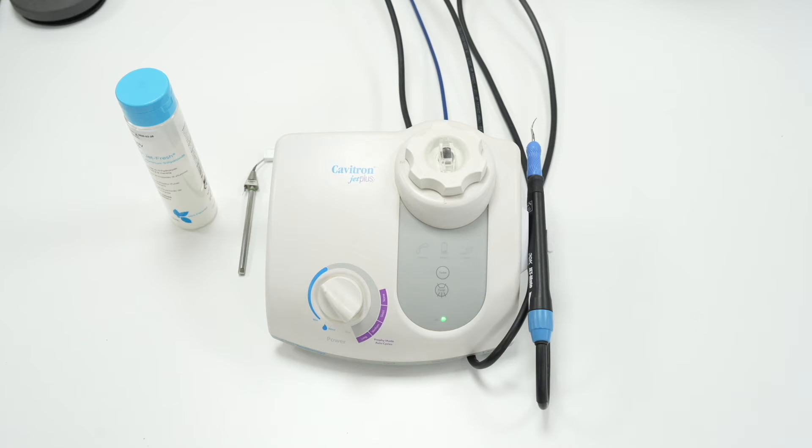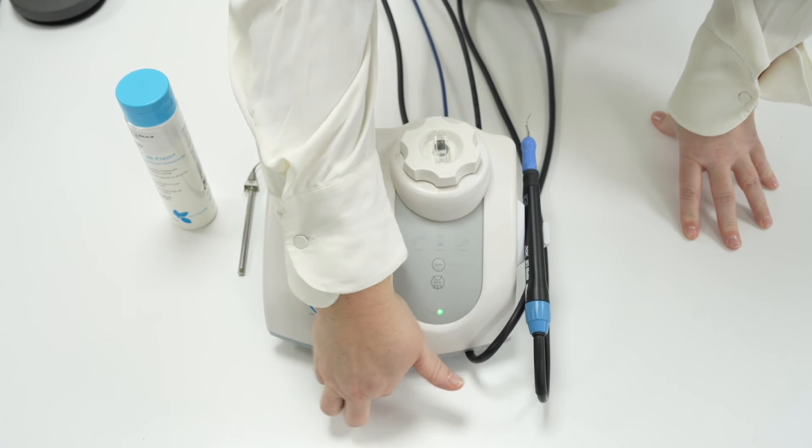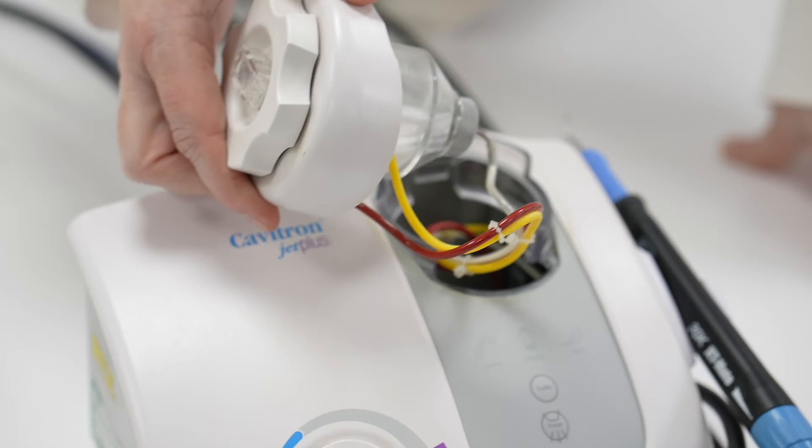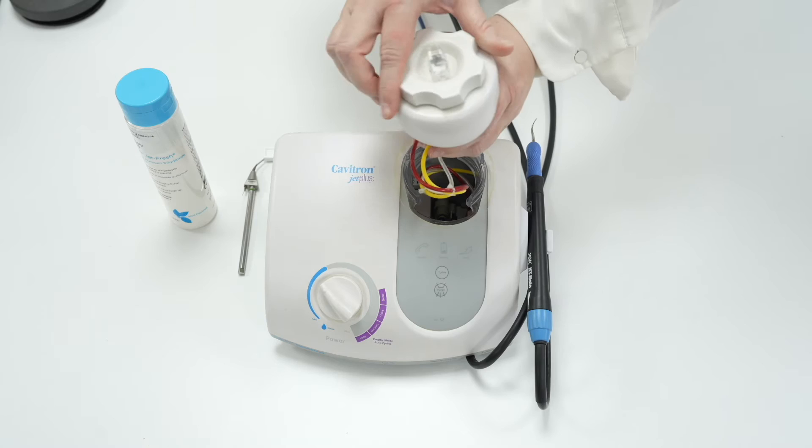To use the Cavitron Jet Plus Profi Mode, check that there is powder in the powder pot. If not, switch the Cavitron off and depressurise the powder pot and you'll hear it hiss. The powder is placed in the pot here.